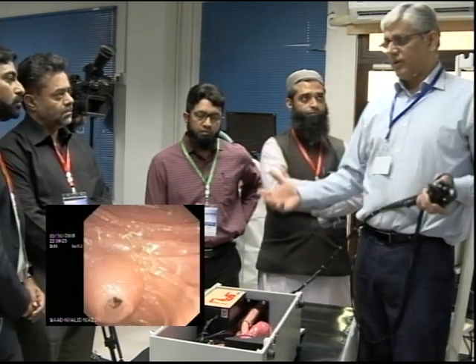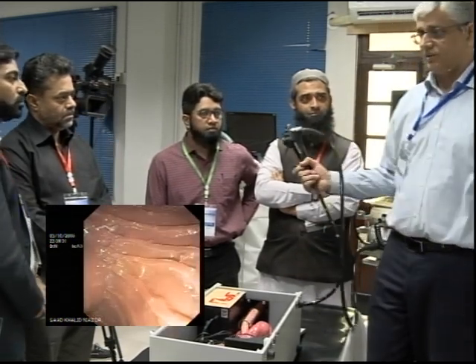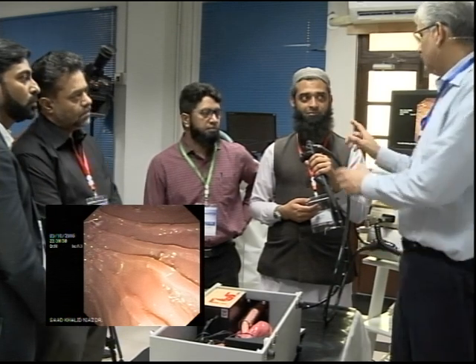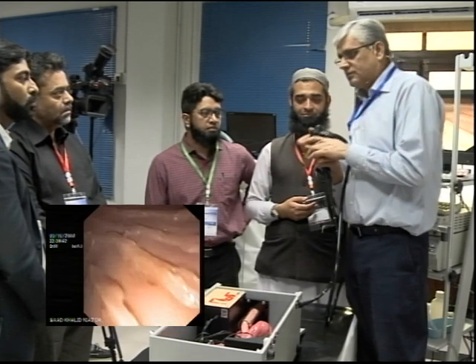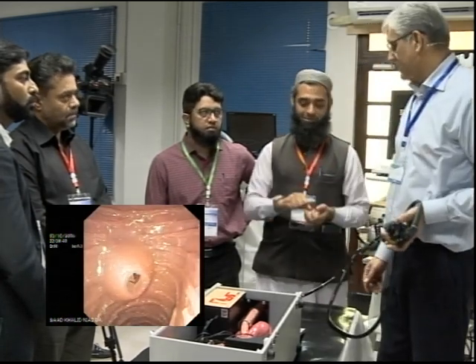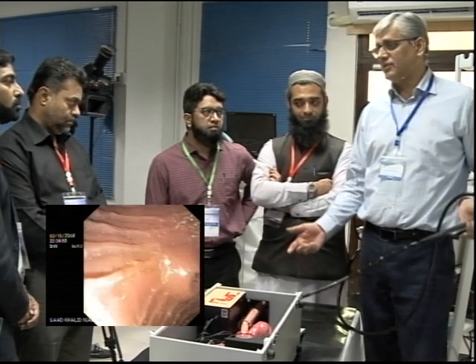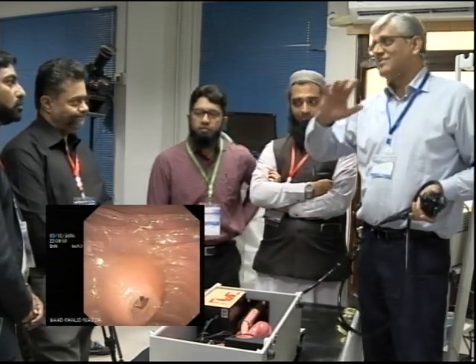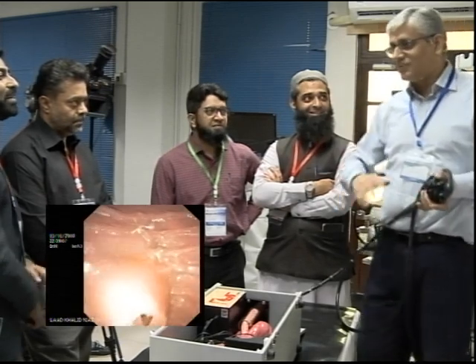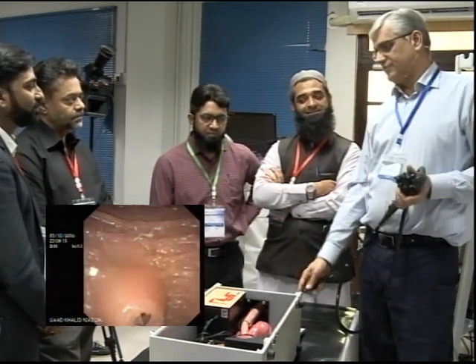Quite often this happens: Dr. Vakar is teaching you. He says, all set, you're having difficulty, here you are, leave it. He gave you the scope. See what has happened. And now you don't see what has happened, you will immediately start. What was not a very difficult thing, all that happened was this. So all you needed to do was this. So this position is so important. You need to understand what the scope is doing to your ampulla. This is what happens regularly when you're training. He'd given it nicely, and who knows where it went. We went away for 2 minutes to do something, and when we came back the scope had turned completely. So that's important, and this position is important in humans when we do that.